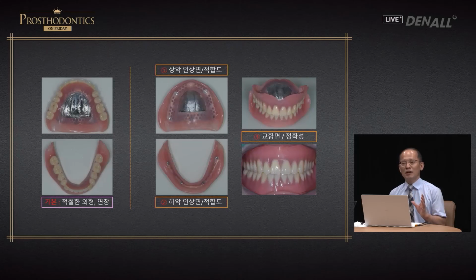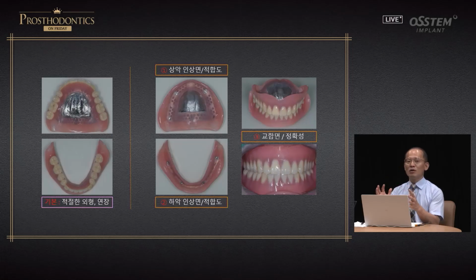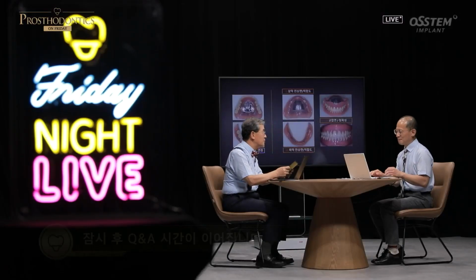The occlusal area or plane is more important than you think, but we do have to use check bite, send a technician clinical remount, and ask for adjustment from the technician. Of course, it will not solve all the dentalist patient issues, but whether you are going to manage or do adjustment, you can distinguish in your protocol and approach with that and have a successful result on your hand.